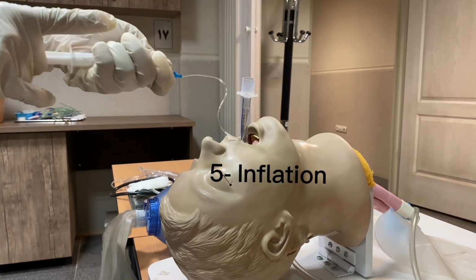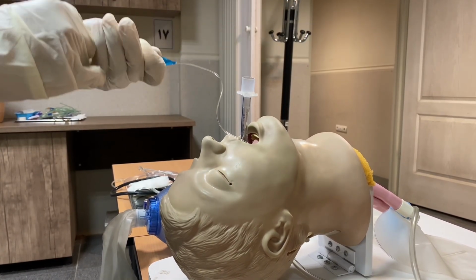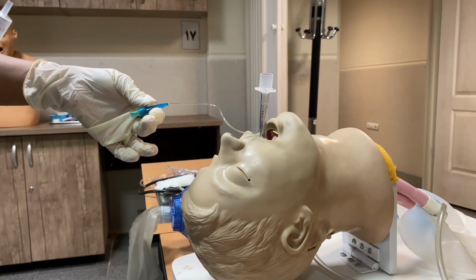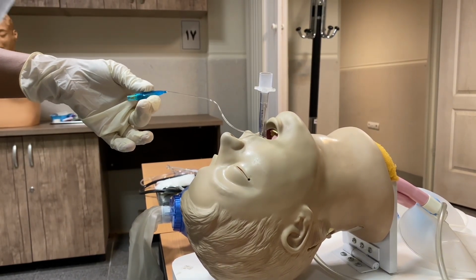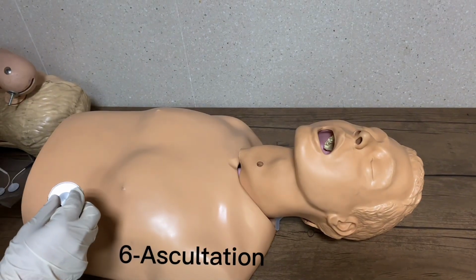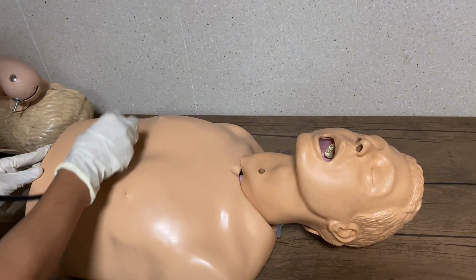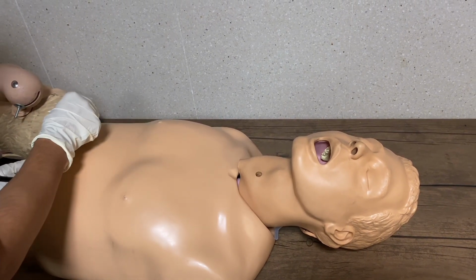Step number 5 is inflation and auscultation. I will inflate the cuff with the recommended volume of air and I will verify the placement of the endotracheal tube by 5-point auscultation: 1 at the epigastrium, 2 at the apex of the lungs and 2 at the base of the lungs.